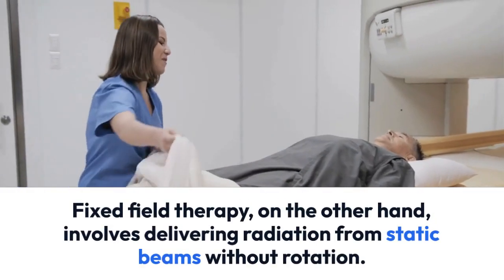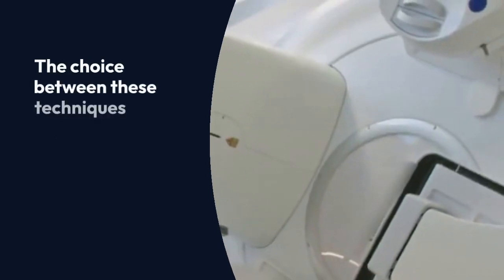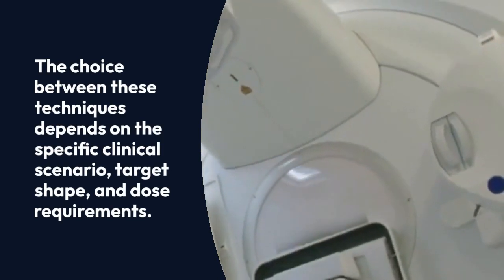Fixed field therapy, on the other hand, involves delivering radiation from static beams without rotation. The choice between these two techniques depends on the specific clinical scenario, target shape, and dose requirements.